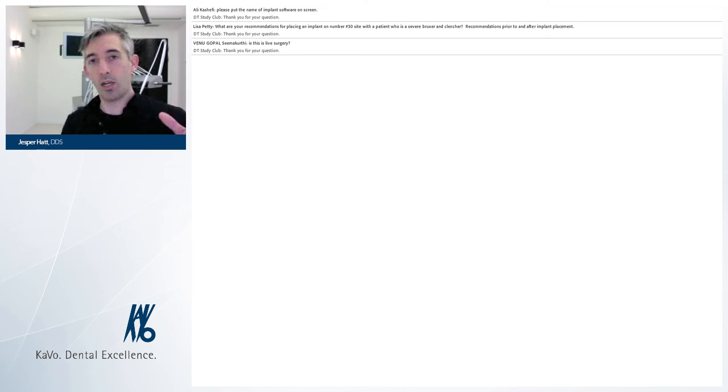So you have the option to have your DICOM files from your cone beam scans and merge them with STL files. You can also just take your cone beam scan of the patient, have a wax-up of one tooth, or you can take an impression of the patient, make a stone model, scan it in your cone beam scanner, and overlay them on each other that way.